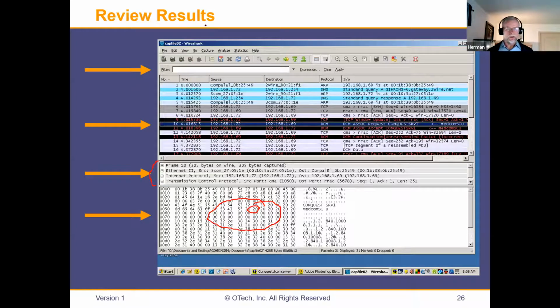For example, if you look at this arrow, this is a DICOM associate request from medcom to Conquest, the PACS. And here's a DICOM associate accept. There's some other junk in between, and there's a DICOM continuation and some DICOM data. So at the top level is where we're interested, and we're looking at the TCP packets. I had to give this introduction, otherwise you might get lost easily.